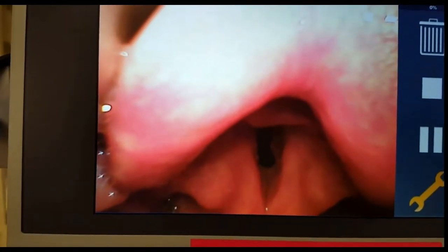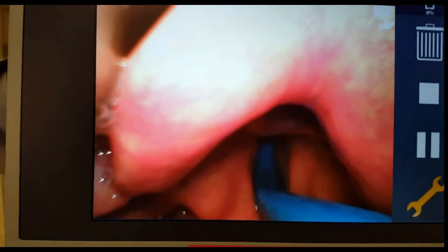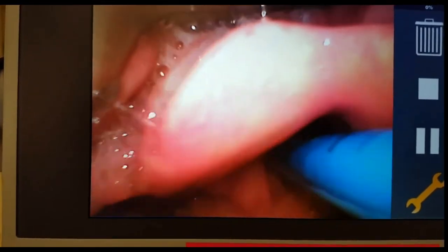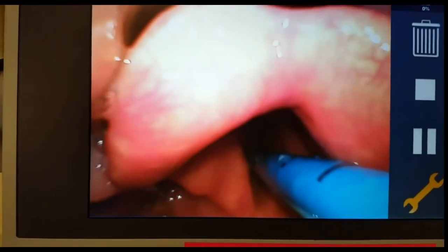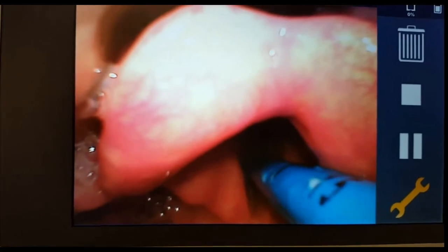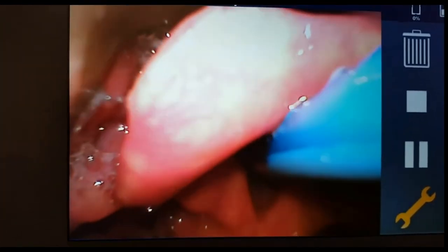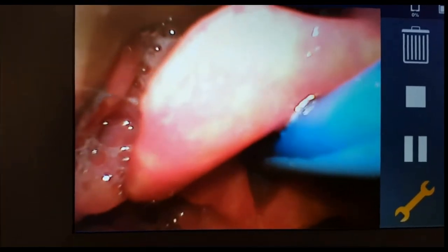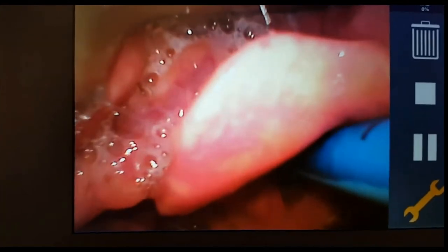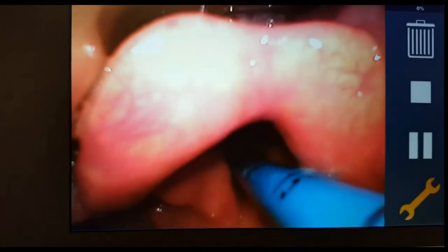Making sure the tip of the video laryngoscope is now in the midline. You can now see a beautiful view of the vocal cords on the right and on the left, along with the arytenoid cartilages. The blue object is the bougie that I have just introduced. Under the guidance of the bougie I am now going to introduce the endotracheal tube.